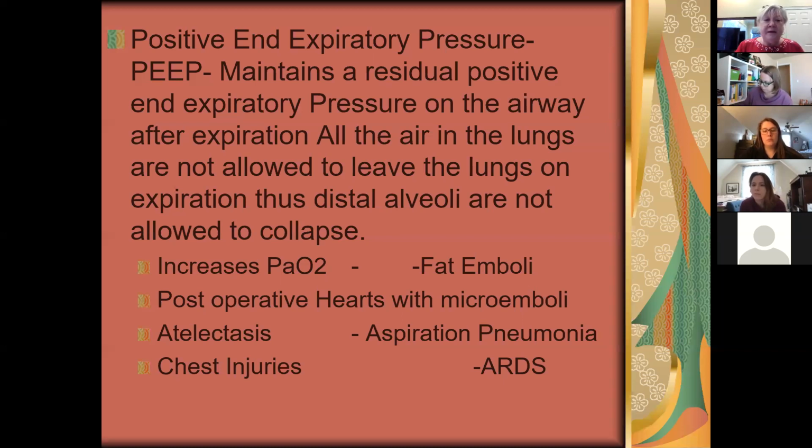Now understand, over here at the bottom of this slide, I've got to try to get my pointer up there. They're at risk for complications from being hypoxic too. So, you know, the old saying, you're damned if you do and you're damned if you don't, okay? So right now we're worried about hypoxia. We'll deal with the complications in a little bit, but let's keep the PEEP as low as we can. That maybe keeps them with the less hypoxia that we can.